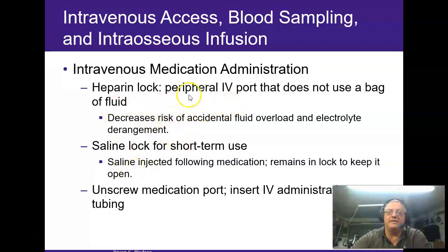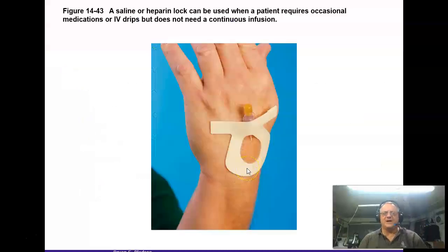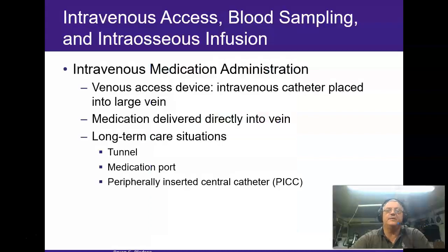But the problem is that they don't have a bag of fluid on them. It's basically just a medication administration port for you to use. And on most of our patients, by the way, this is probably what we're going to start on them. Nowadays, very rarely do you just hang a bag of fluids to hang a bag of fluids, even though most people walk around a liter low.